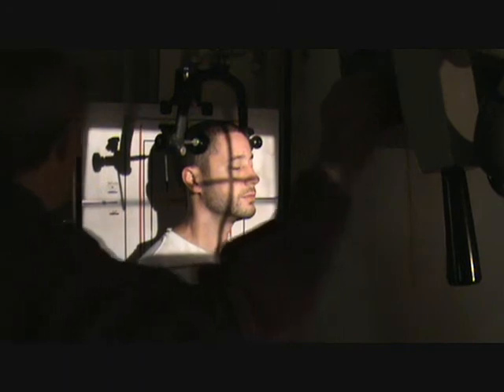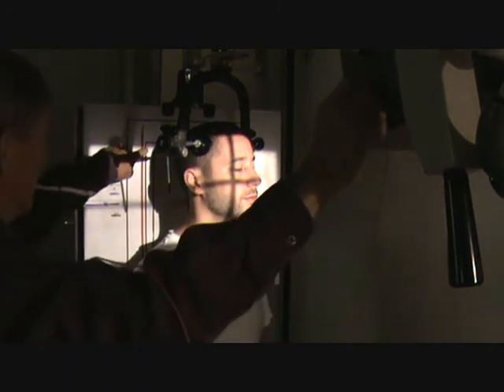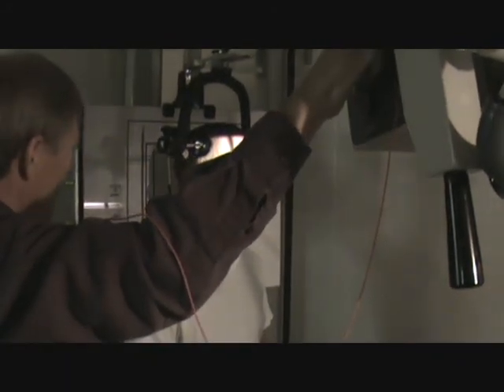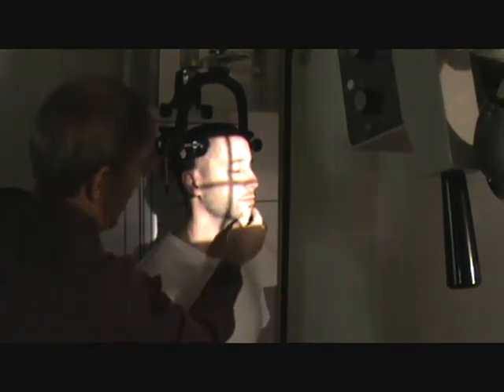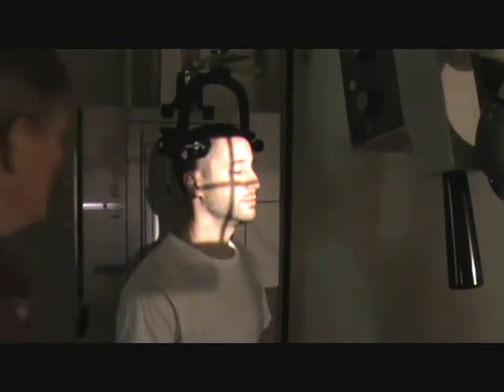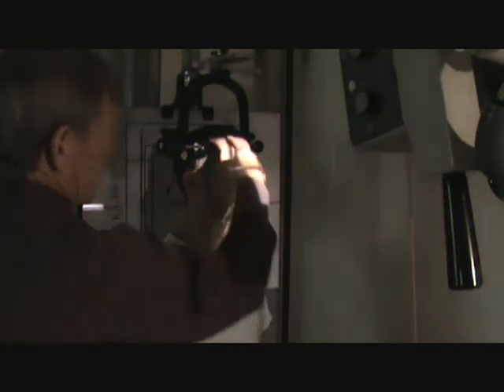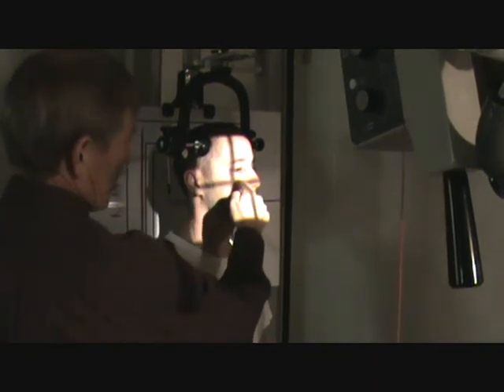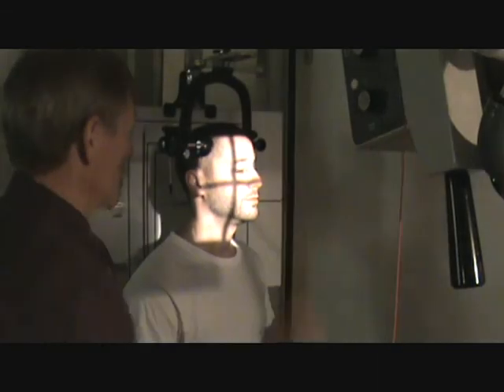I'll collimate top to bottom, half inch inside to about a 10x12 border, and collimate into my R marker. Just drop that chin just a tad. We have the ear pointers lined up on both sides, vertical collimator crosshair through the point that we need to go through, horizontal crosshair through the middle of the maxillary sinus and TP on the other side, and this dot lined up with the normal head carriage dot on the chin.